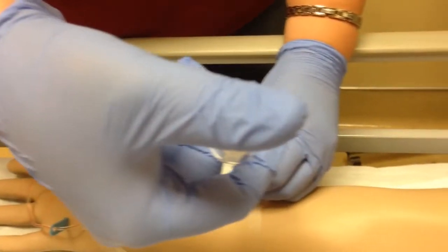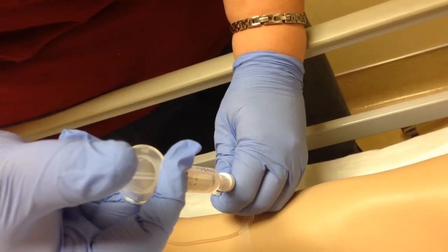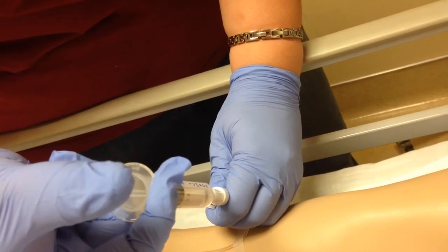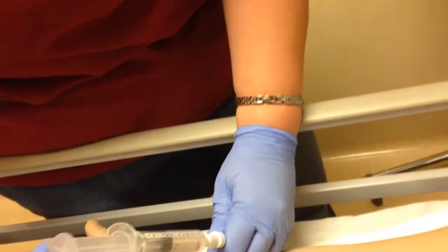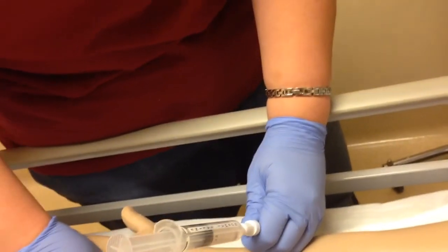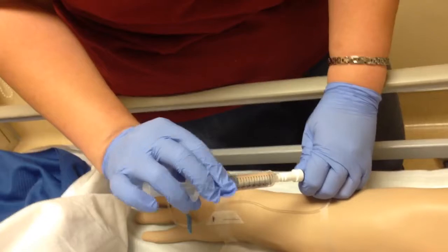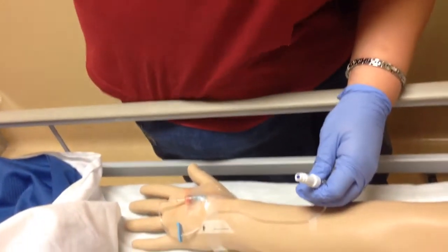And now I'm going to flush 3 milliliters of saline just to make sure it's patent. Okay, so it is patent. All right, I'm going to set this to the side.